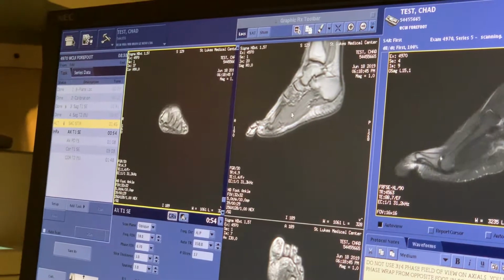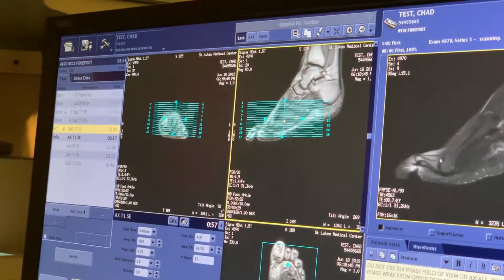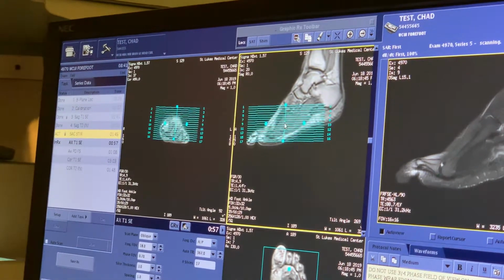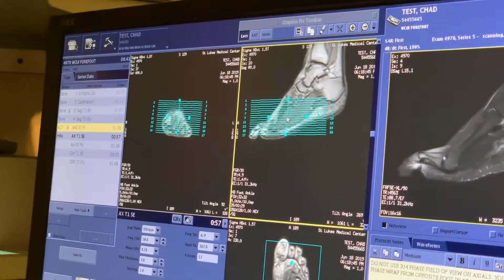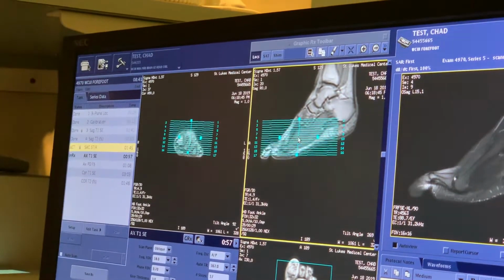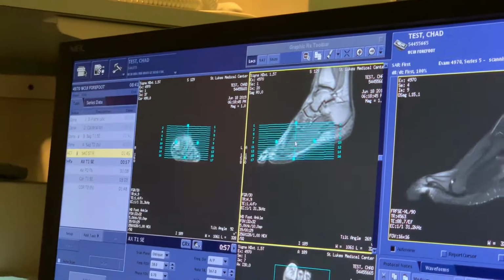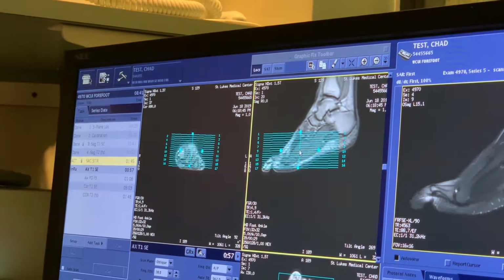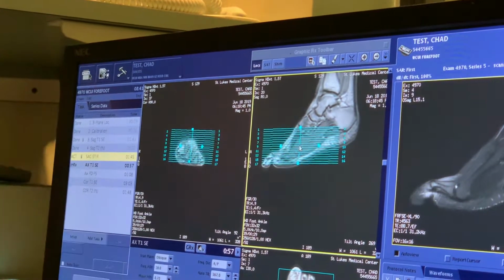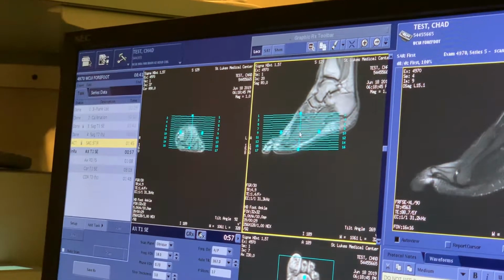And then because it's an axial, I'll throw down in the sagittal and get a pack like that. If I got more of smaller slices, I'd be just assuming that, hey, I'm doing a short axis axial. If they're bigger slices like this, I can assume that they want me to do a long axis axial. So if I came to a machine and I didn't work on it before, and I clicked on it and I got this long slice like that, obviously they want a long axis axial, okay?